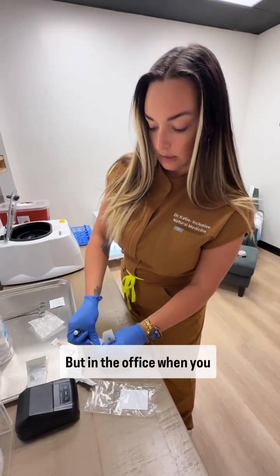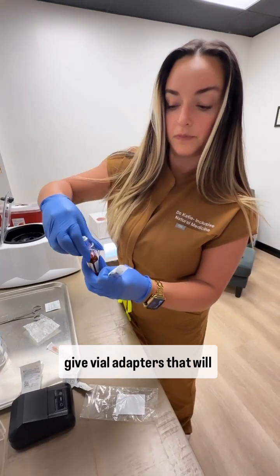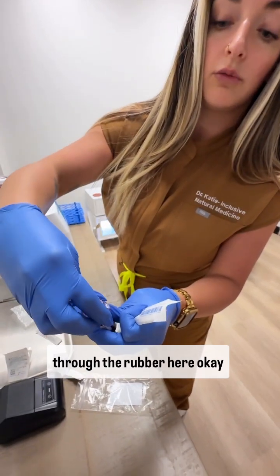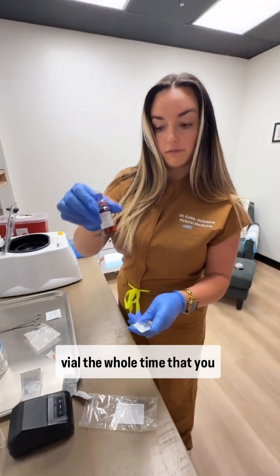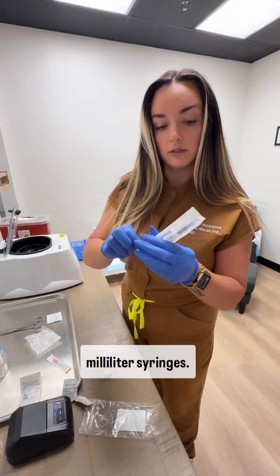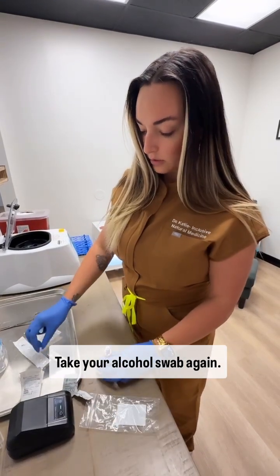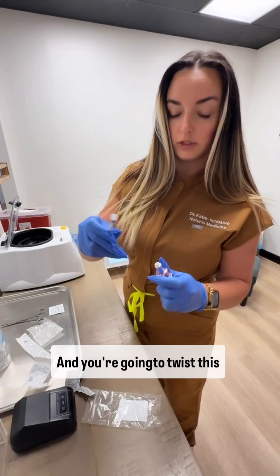But in the office, when you get your injections done, we give you vial adapters that will go in. That part pierces through the rubber here, okay? And then this stays on the vial the whole time that you use it. You should have received also 1 cc syringes or 1 milliliter syringes. You pop that open, take your alcohol swab, again, swab the top, and you're going to twist this on.